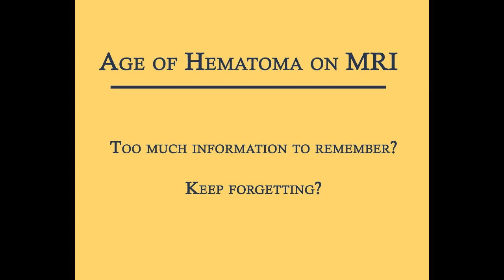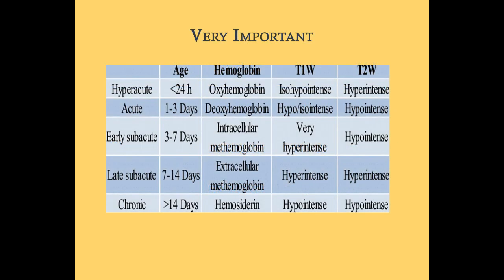Today's topic is age of blood products on MRI. Is it too much information to remember? Well, let's try and simplify it. Now this table is very important, not just for daily practice but also for exam point of view. A question on it is a must.